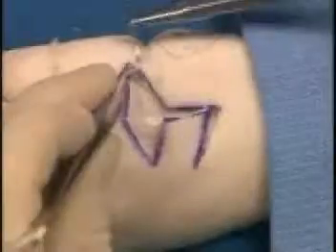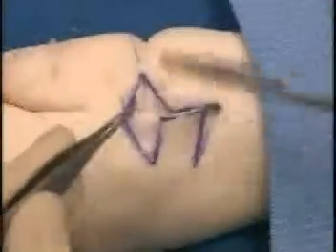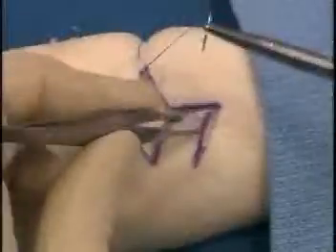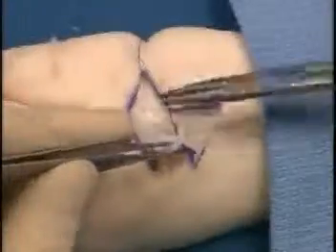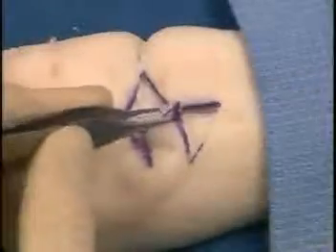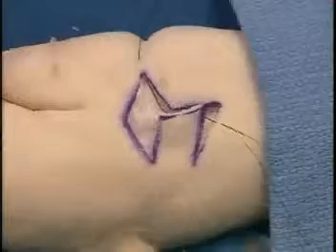Once the flap and adjacent tissues are widely undermined, then the flap is rotated into position. The point of maximal tension of the flap here is seen with the first suture. All apices of the flap are then sewn.